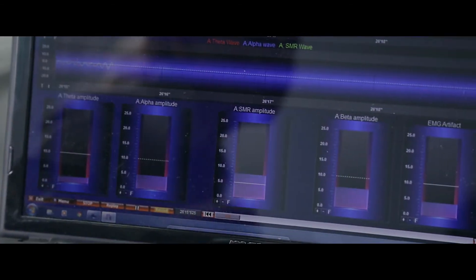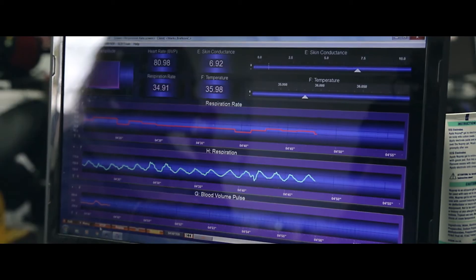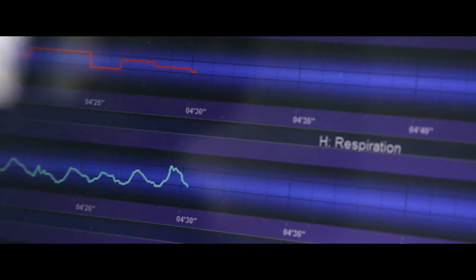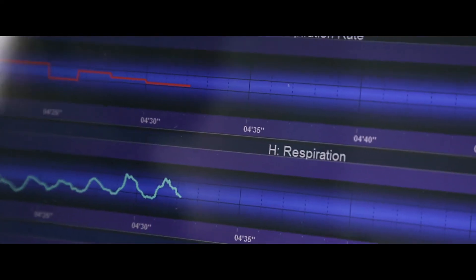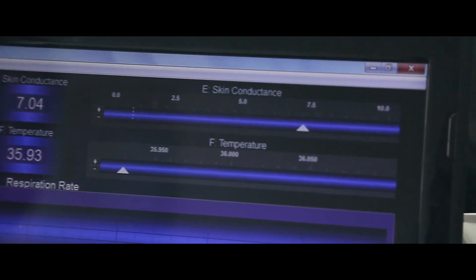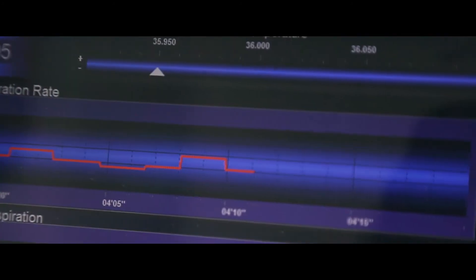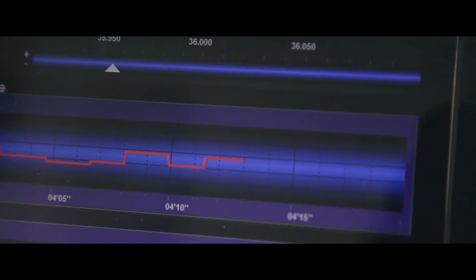The brain frequencies we are measuring are theta slow brain waves, alpha, SMR (sensorimotor rhythm), and fast beta amplitude. Here we also have a multi-modality biofeedback screen where we can monitor the driver's heart rate, finger temperature, respiration rate, and skin conductance stress level.